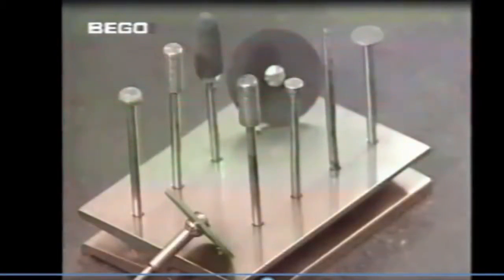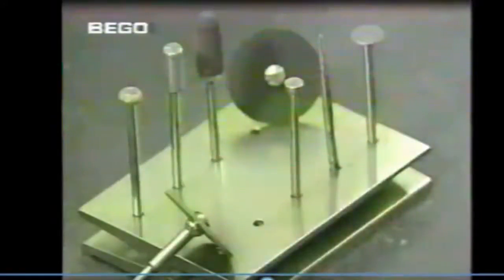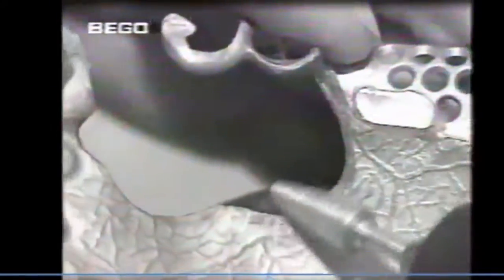The dorsal finishing line is smoothed with a fine-grain grinding stone or, as in this case, with a sintered diamond one. When using sintered diamonds with a diameter of more than 5 millimeters, the speed is reduced to 10,000 revolutions per minute. The finishing lines must be demarcated carefully. The tips of the clasps and the rests should be rounded slightly.